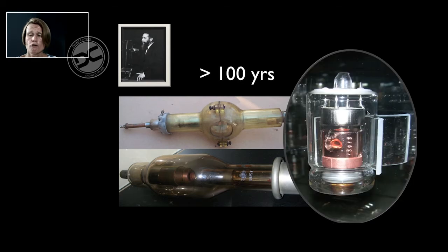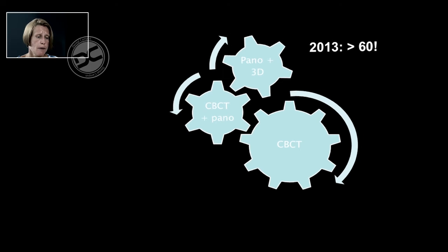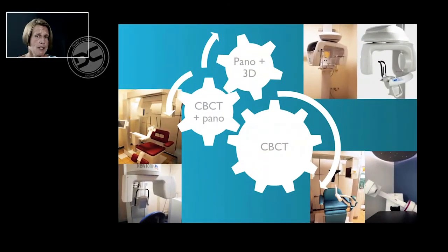Nowadays, there is a variety of cone beam CT machines on the market, going from panoramic machines to proper cone beam CT machines, and in total there are more than 60 different machines available. Some of these machines are basic panoramic machines with a 3D option, but still they have an integrated cone beam.